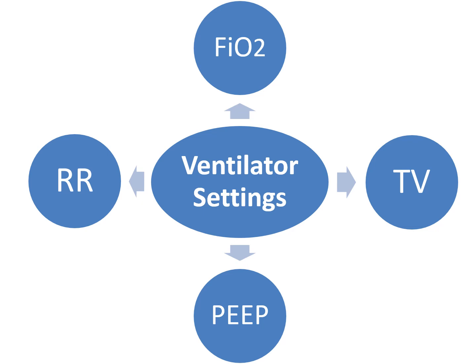Typically, you'll see a respiratory rate of 10 to 20 breaths per minute. So your oxygen concentration, your FiO2, is the percentage of oxygen being delivered to a patient. FiO2 is the abbreviation for fraction of inspired oxygen. And typically your oxygen level is 21% room air to 100%.